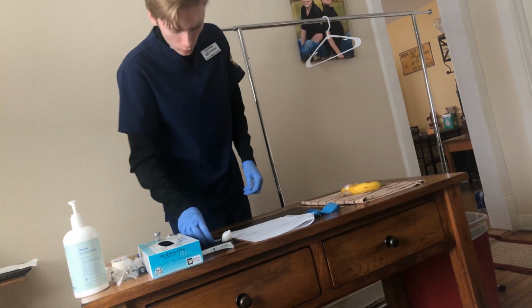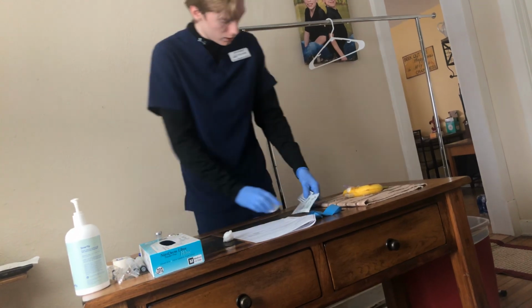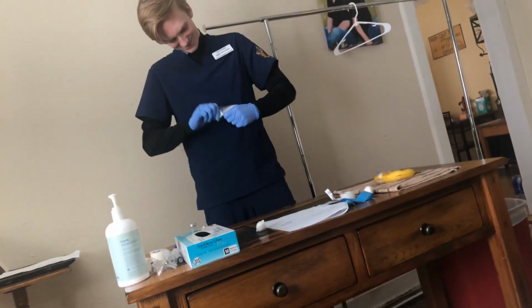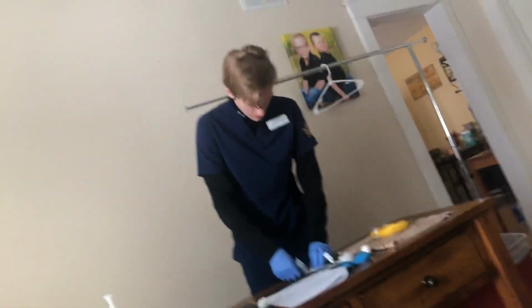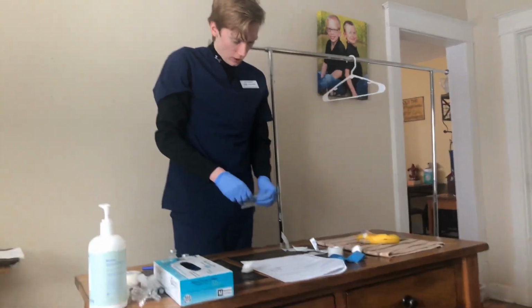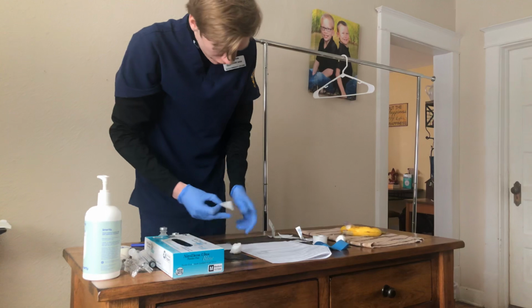So I'm going to come over here, get my alcohol, get my gauze, get some tape, get everything ready. And get another thing of gauze, just for the sake of equipment that we do not have as nursing students.